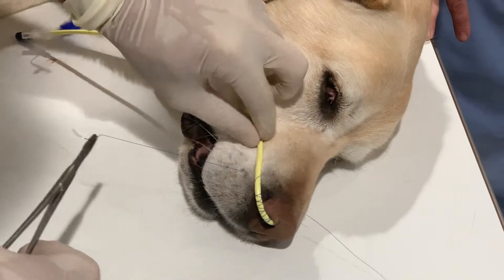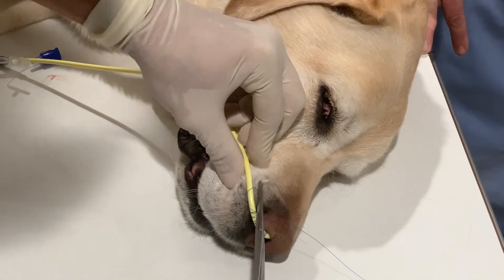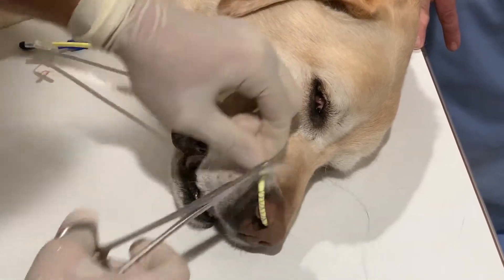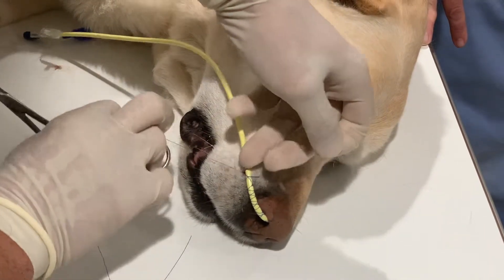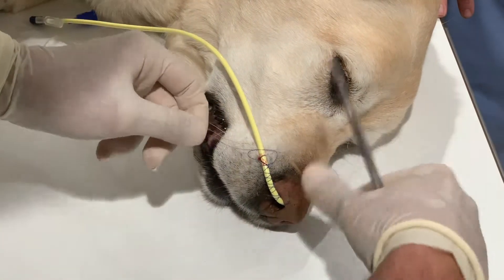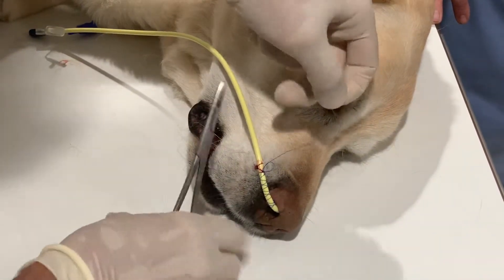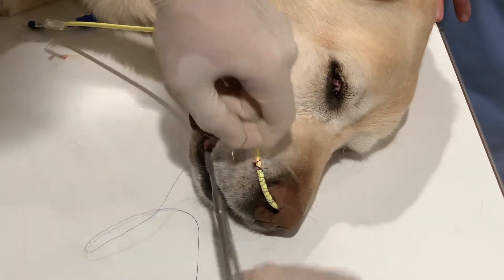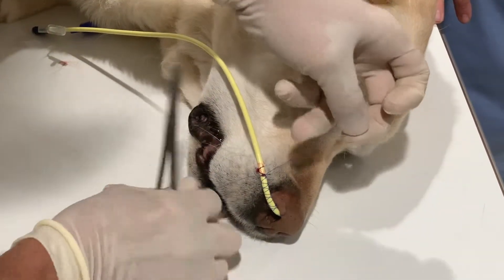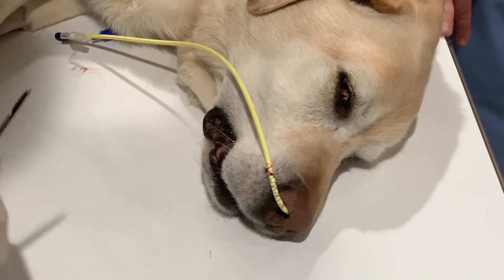So I'll take one bite through the skin, around the feeding tube like that, and then take another bite through the skin. There are lots of variations of this, but I tend to be a little more aggressive. A lot of these pets are very sick, and if you can just place the feeding tube in one time without having to replace it again because they pulled it out, you'd like to do that. There's a little bit of bleeding here, but that'll resolve on its own. Do about four or five throws. And there's the finished product — we've got a nice looking feeding tube.